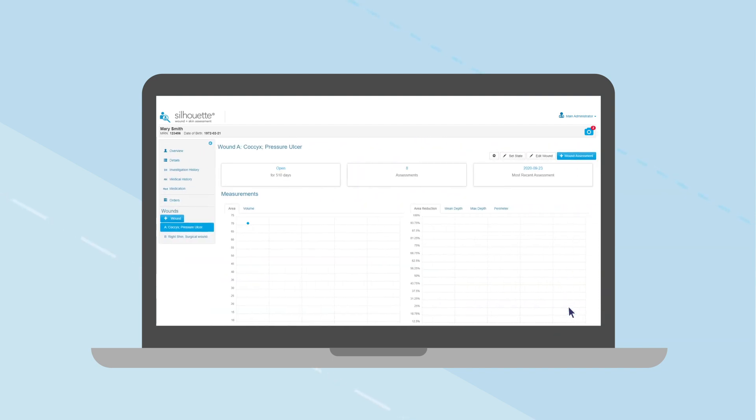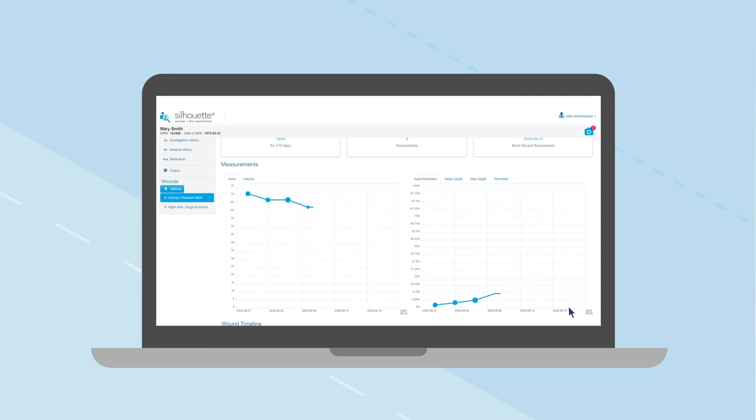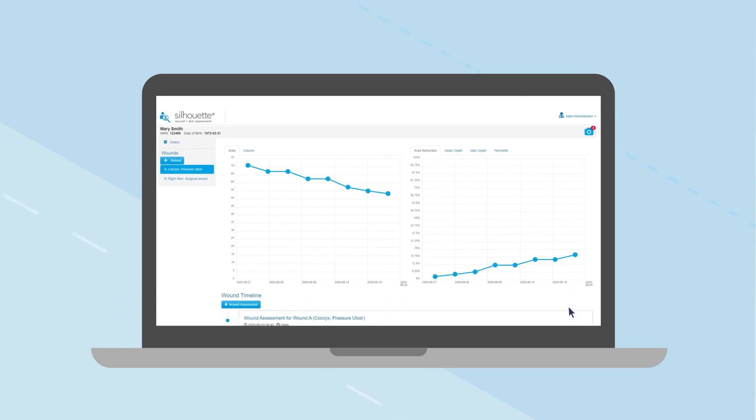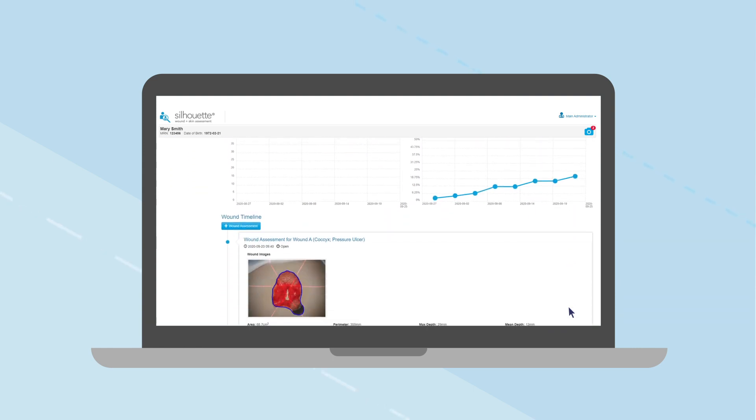Save the assessment to return to the wound overview information and patient timeline.